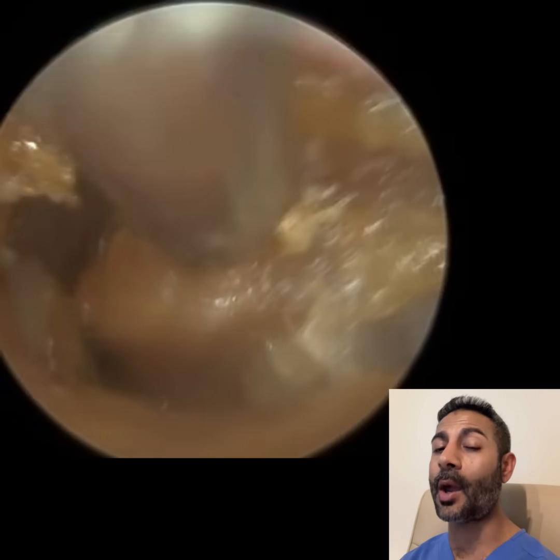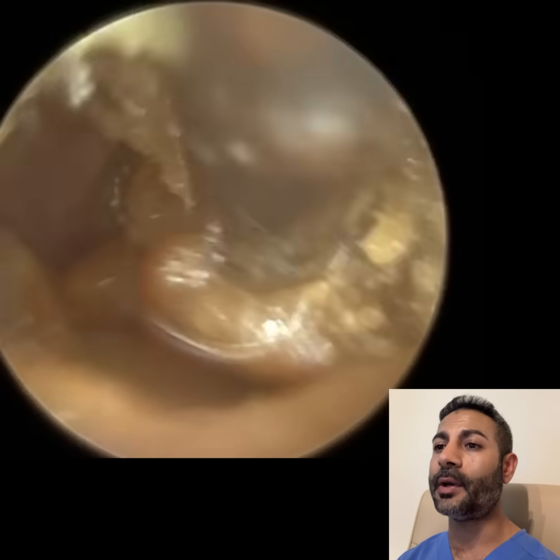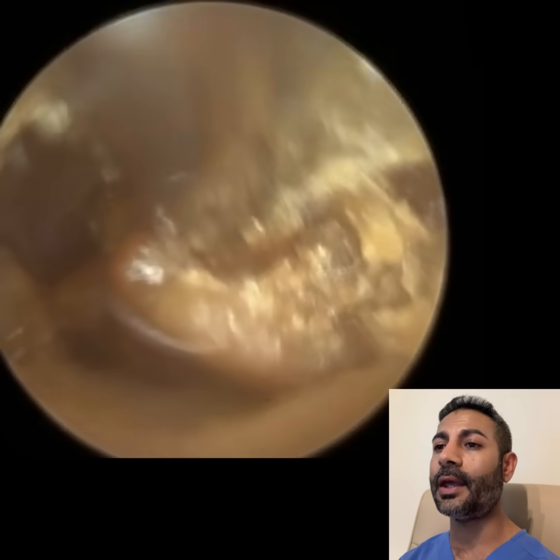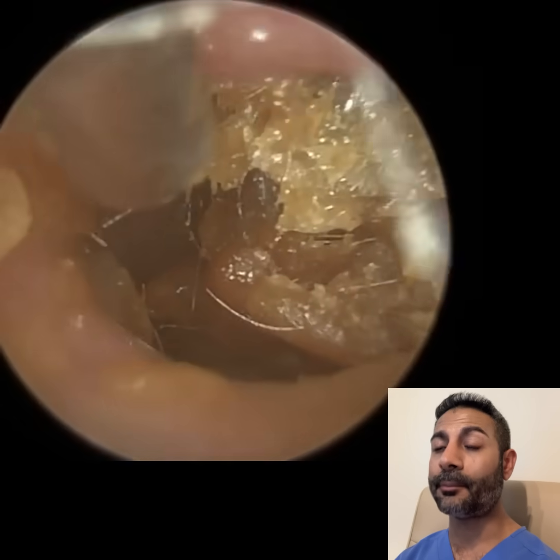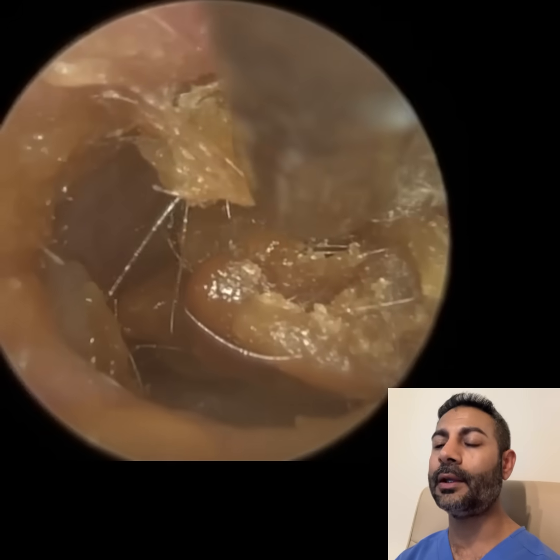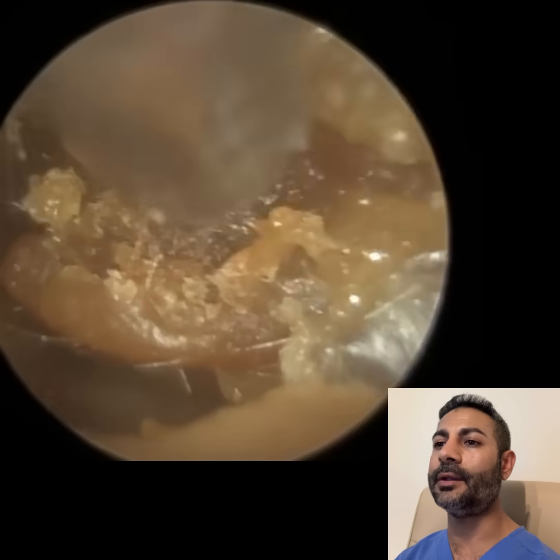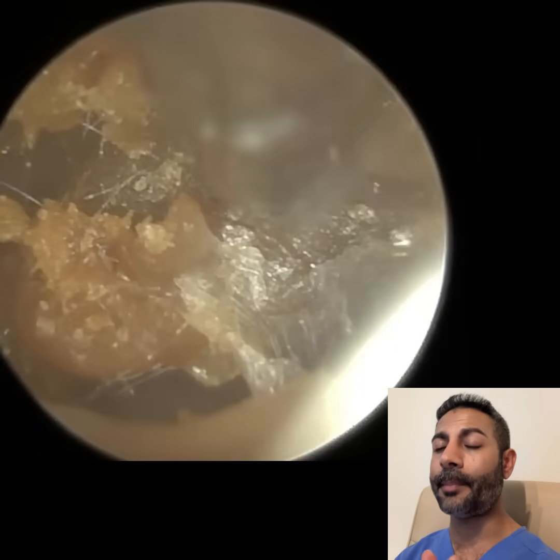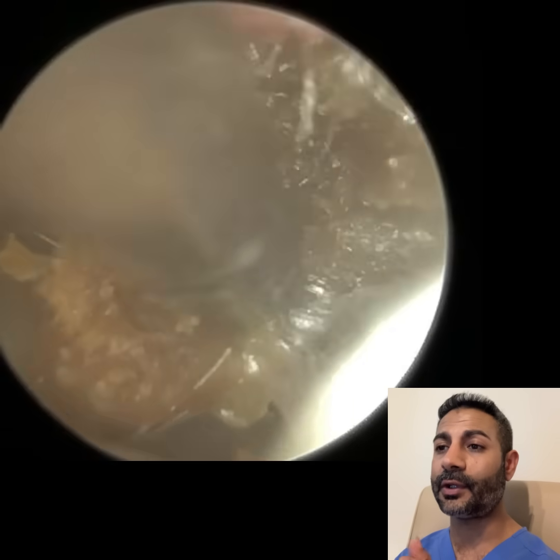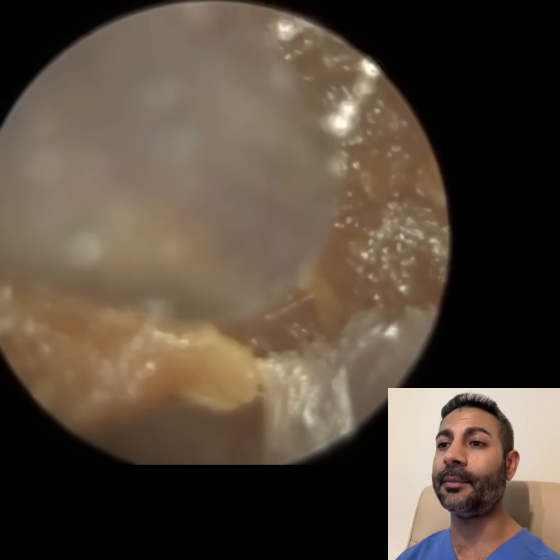Surfer's ear is when you have some bony protrusions — like osteomas, which are bony spurs, bony growths in the ear canal — and it's typically as a result of exposure to cold water predominantly. It can also be cold air. The bony part of the ear canal is lined with the thinnest layer of skin, less than 0.1 millimetres in thickness — that's your epidermis layer.